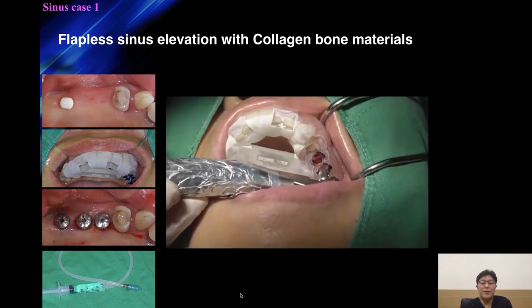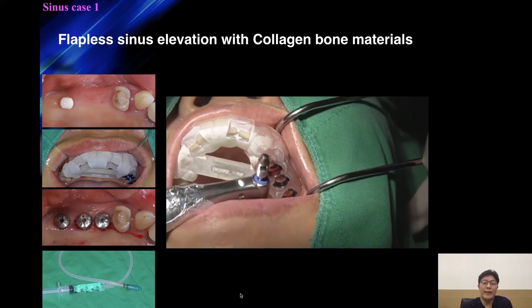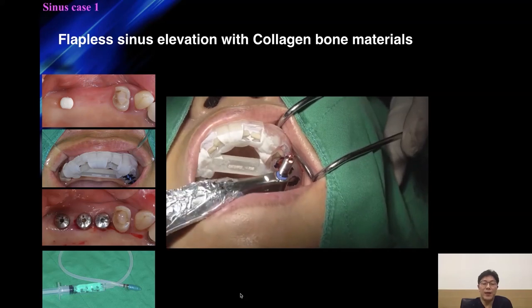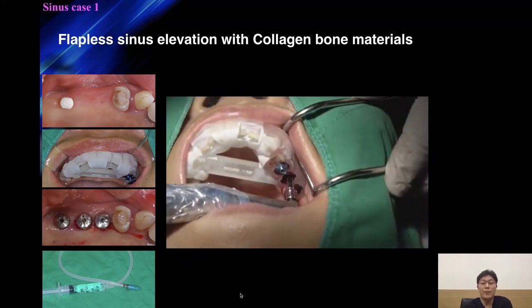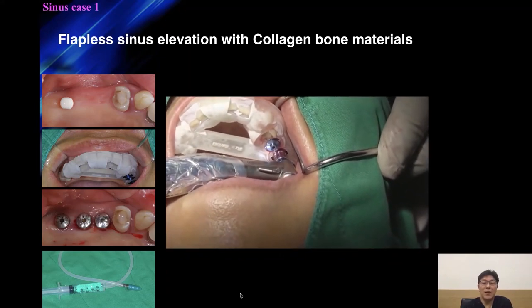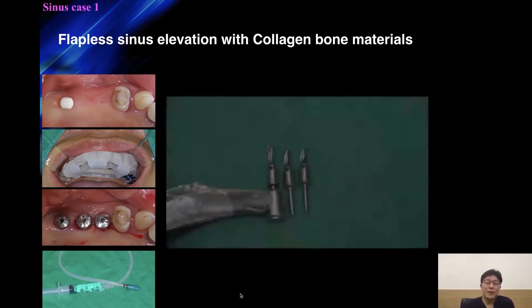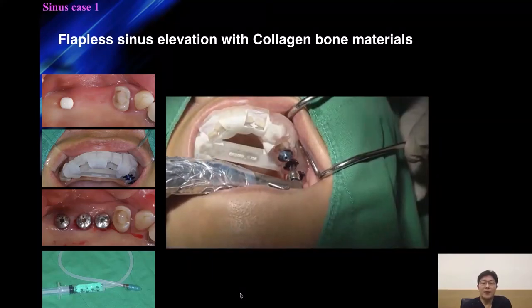With these two data sets, I planned three implants in Implant Studio on the 3Shape program. I used a tissue-first approach followed by a bone-flattening drill, then general drilling with a stopper under one millimeter short of the cortical bone. Surgery was performed according to this protocol.